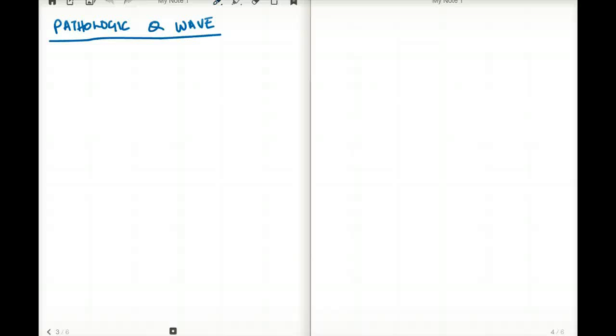In this video, I'll be talking about the pathologic Q wave. The reason I'm calling it pathologic is because we obviously see a Q wave in a normal EKG, and then there is a pathologic Q wave which we see during MI. So before we understand pathologic Q wave, we first have to understand what exactly is the normal Q wave, and then we'll talk about pathologic Q wave. So let's get right into it.